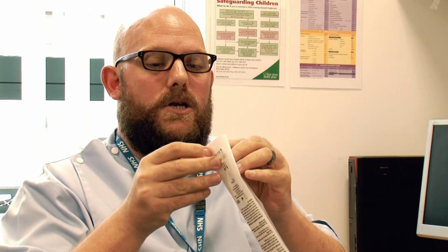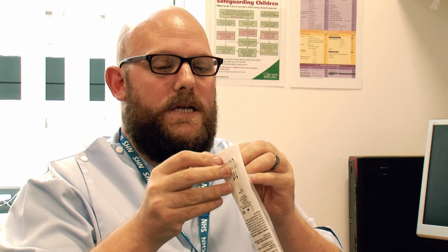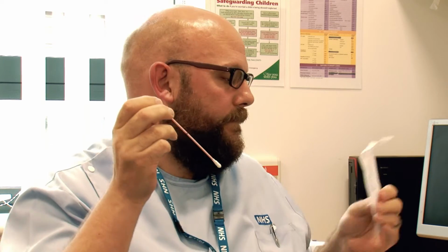Now, vaginal swab. The vaginal swab will come like this in a package. I'm just going to open this package and get the actual swab out. Inside, pretty similar. You'll have a bottle like the one before, but this is for the swab. There's liquid in it, so be careful not to spill it. Lid off to one side, and in here you have your swab. So open your swab. Now there's a little cotton wool ball on the end. You insert this inside your vagina, not too far, and swab it around. Lid off, swab in, snap the swab, lid on tight. So that's the vaginal swab.